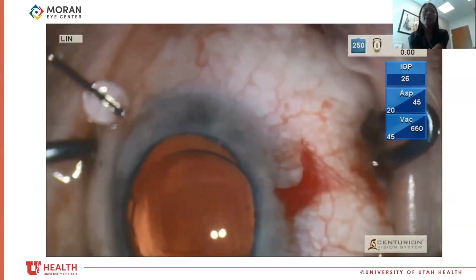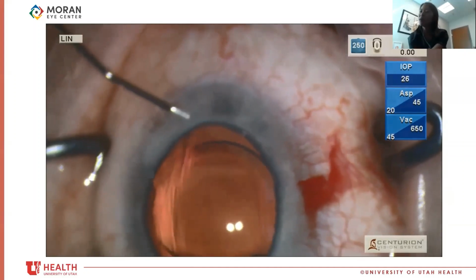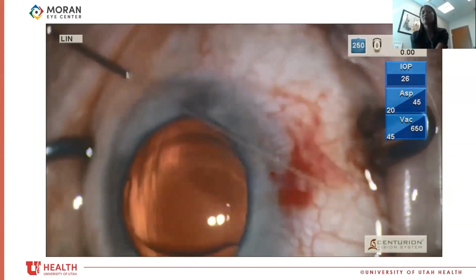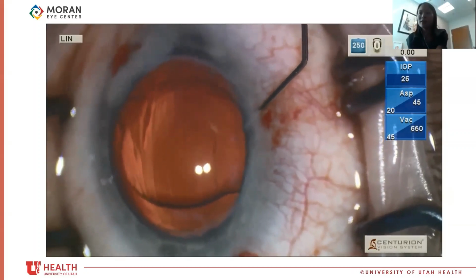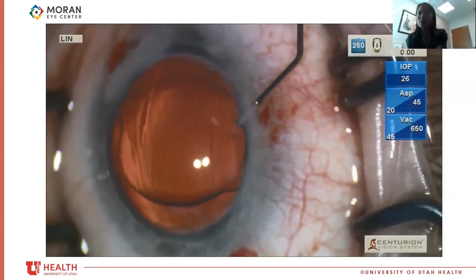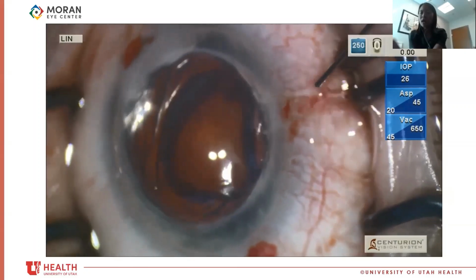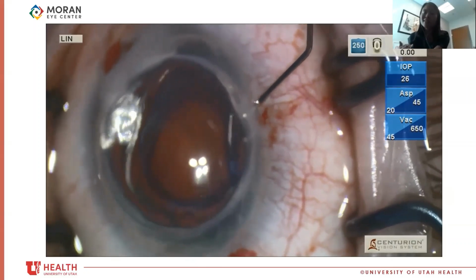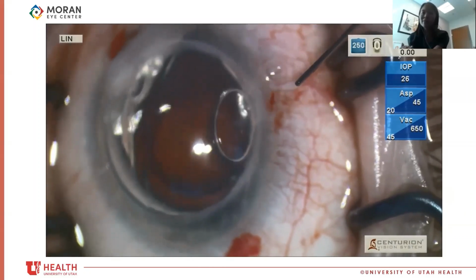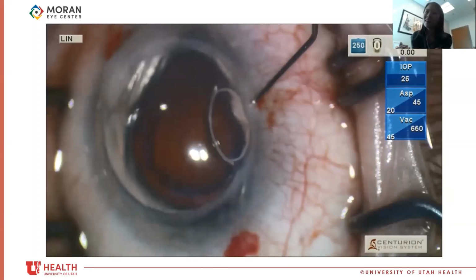So I'm buying time by hydrating the wound as I think about what I'm going to do next. So again, I've got a big fluid BSS pocket above Descemet's. So I try to get some air in underneath, but it's hard to tell in this video, but I went into the same channel. I've just put air into that space.